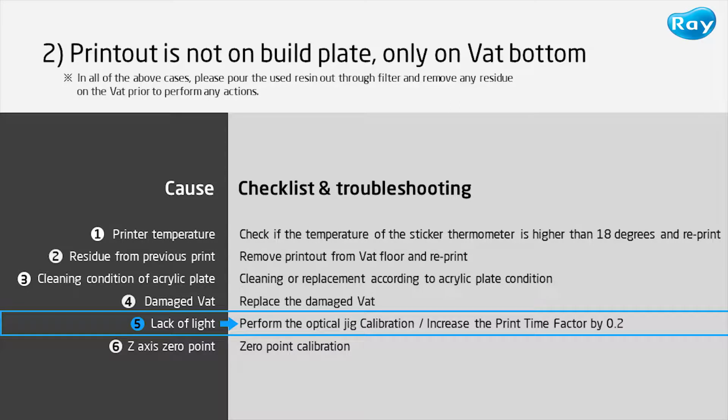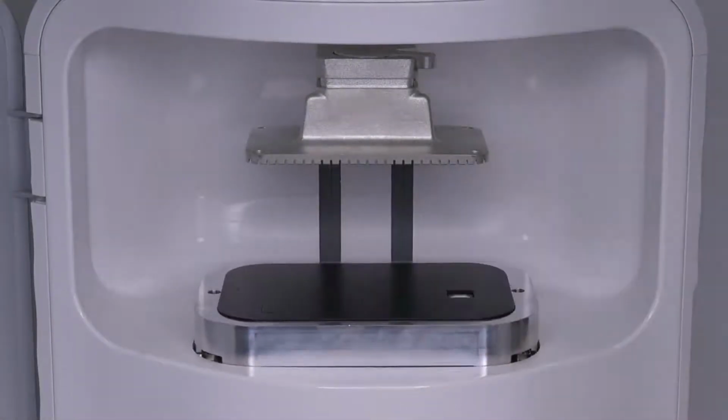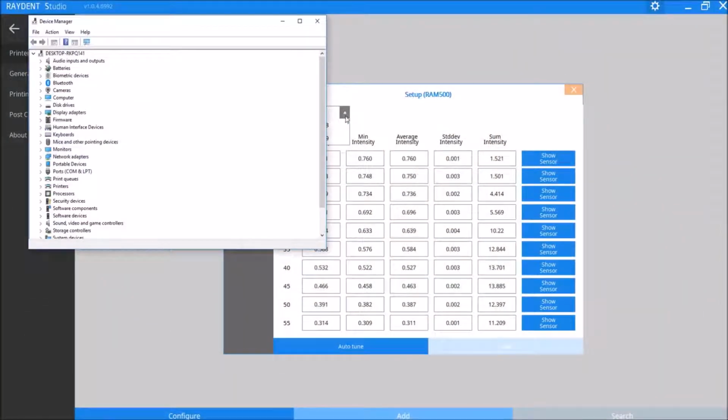The fifth cause is when the printer has low light power. If the light power is low, there will not be enough power to cure the object, which also leads to print failure. In this case, the light power has to be measured and calibration should be carried out. Remove the build plate and VAT, attach the light jig to the VAT position, and connect the USB port while connected to the printer. Open the device manager to check if the computer recognizes the jig.